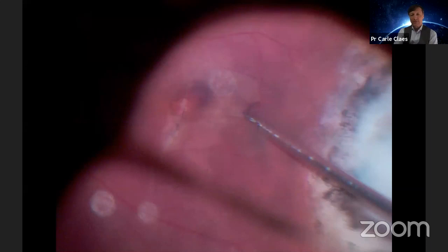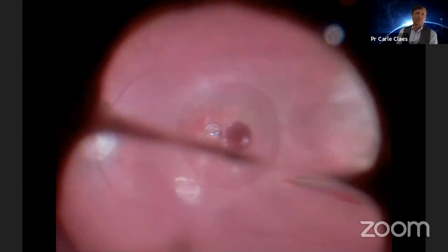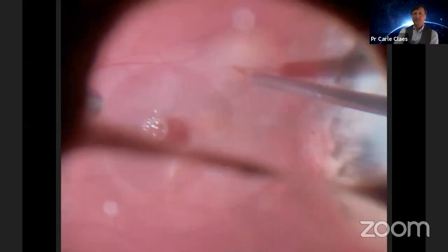Explosion trauma, and we peel the membrane around the hole. Then we will put a small bubble of decalin on top of the hole to cover it, and we will inject with a 40 gauge needle. We will inject subretinal BSS to detach the retina around the macular hole, which is still covered with a decalin bubble.